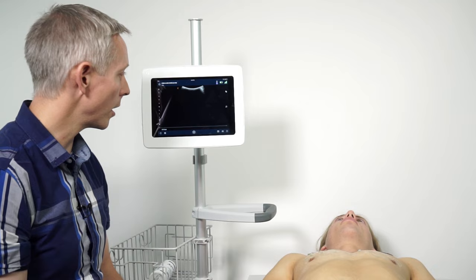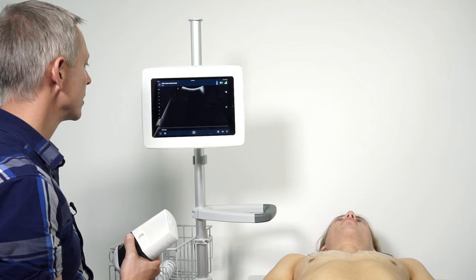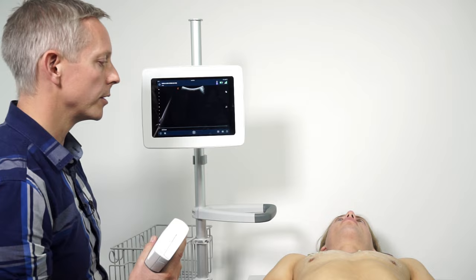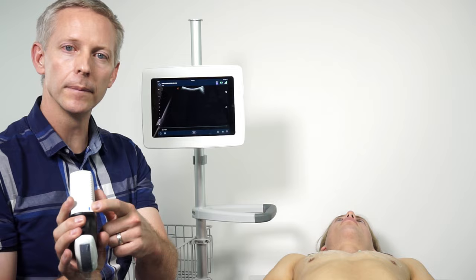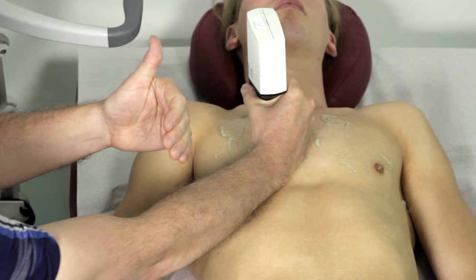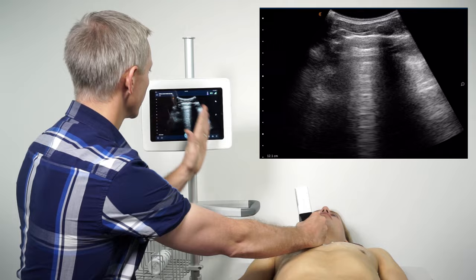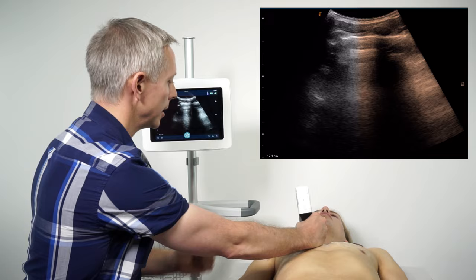Next we'll move on to a systematic approach to scanning the entire lungs. I've got the depth of the transducer at at least 10 to 12 centimeters. I'm going to start on the patient's anterior superior chest in the sagittal plane, taking the transducer marker and orienting it up towards the patient's head. In this position, everything towards the left side of the screen is up towards the patient's head, and everything towards the right side of the screen is down towards the patient's feet.